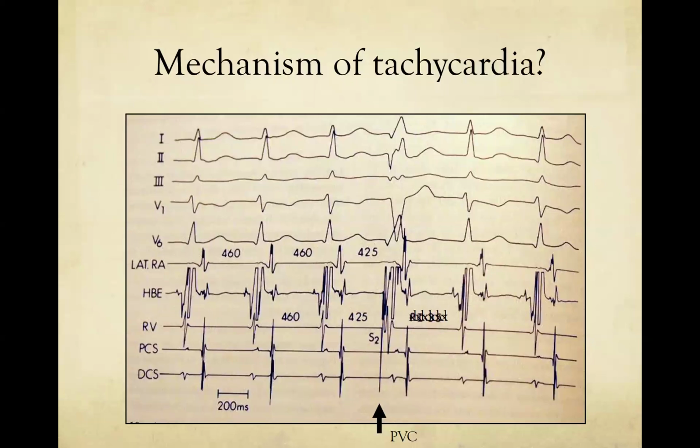And again, these are all just clues. None of them are definitive, but it's like when you're doing an EP study, we're often gathering our evidence to make a diagnosis.